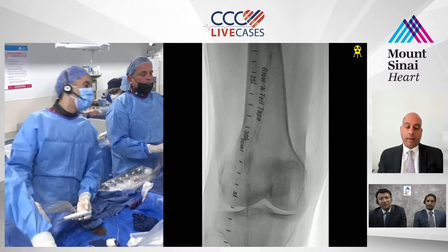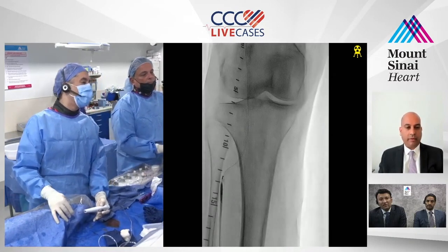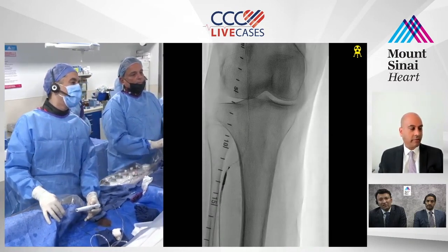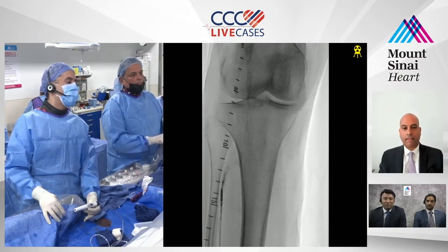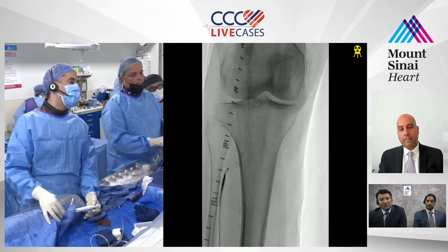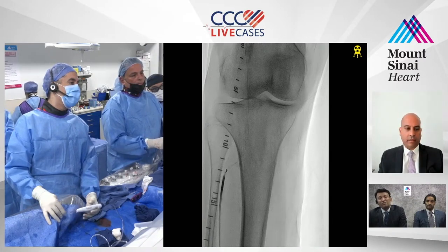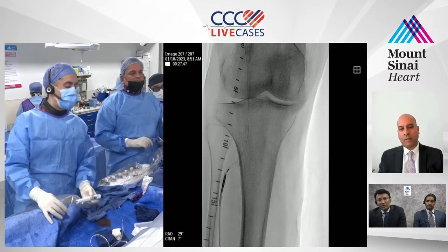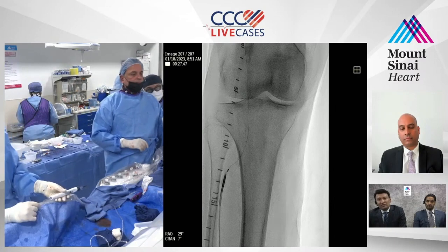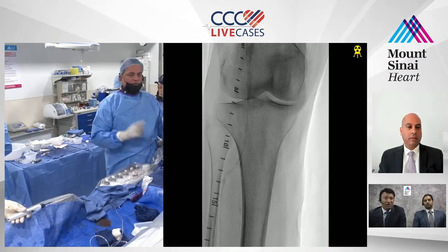Let me see. I haven't noticed, to be honest with you. I think they're both a little bit bulky around the turn. I don't have enough experience with Pioneer to tell you, Karthik. Okay, because I don't use Pioneer that much either. Nope, not going to go. No. I think the only difference is, isn't the Pioneer tapered a little bit more at the end? That's why I thought, normally it's a bigger device, but it just makes through the bends much easier because it's tapered at the end. That's what I thought. But let's try.